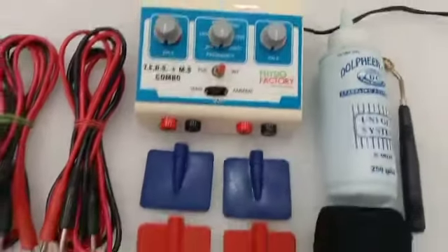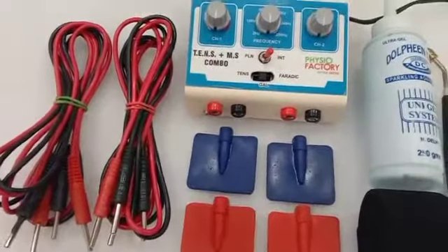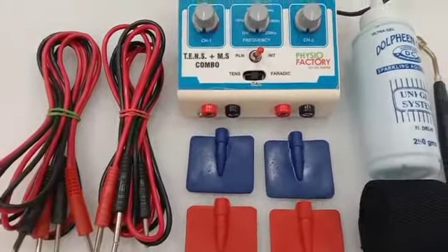This is my new video about the TENS and MS combo machine. I'm going to show you how to start this machine. Firstly, let me tell you — this is a mini TENS and MS combo, and it is fully portable.